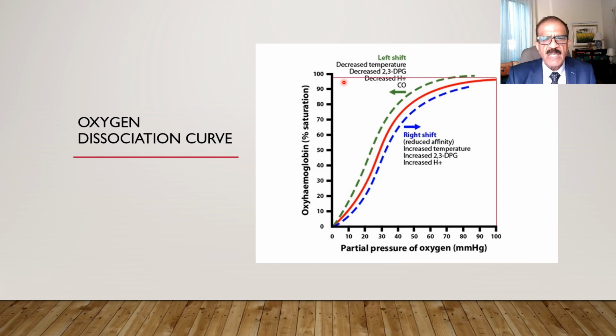I think it is hardly ever 100, it is usually 99, because after the blood passes through the lungs, there is some admixture of bronchial blood coming from the bronchi. So the partial pressure of oxygen and oxygen saturation is usually slightly less than 100. So this corresponds very well, but as the level drops, you notice that oxygen partial pressure has dropped very significantly.